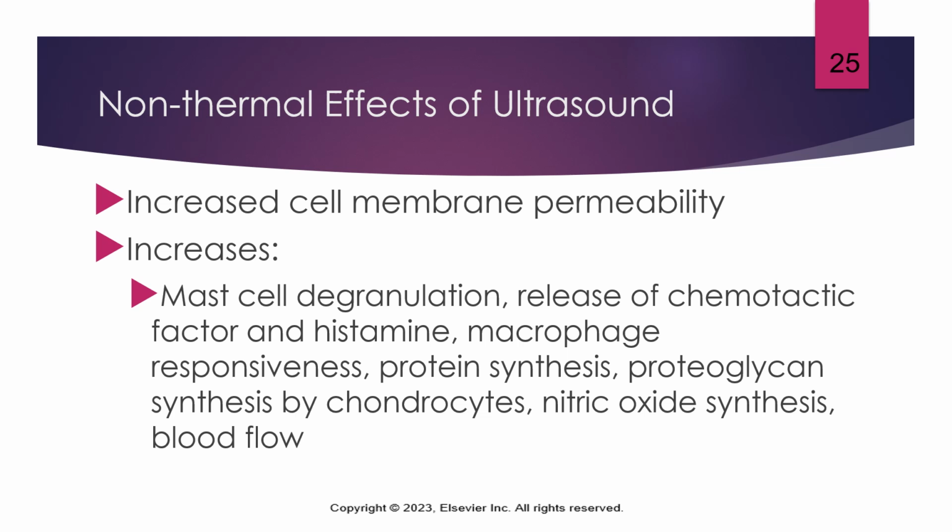It stimulates cells to produce proteins essential for tissue repair, so that's protein synthesis. It stimulates chondrocytes, or cartilage cells. It also helps with nitric oxide synthesis, which helps to promote blood flow and cellular signaling, again increasing blood flow. So we can get all of those responses through this cell membrane permeability, which is only really possible through that cavitation, that stable cavitation form.